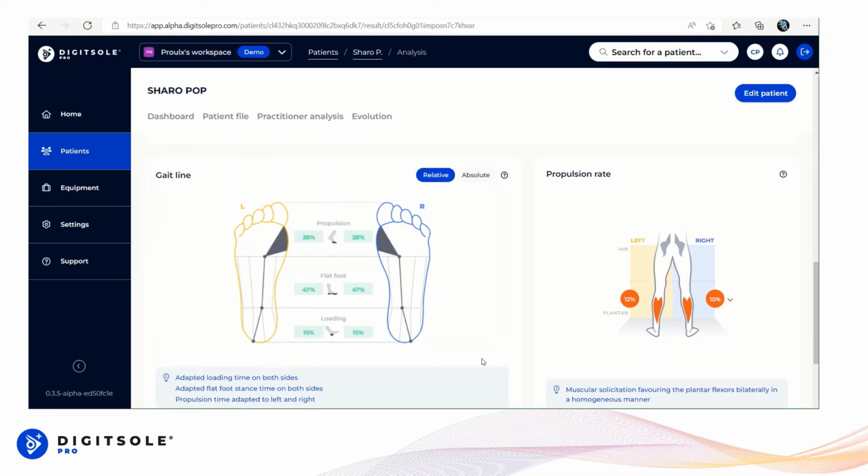So we can see at heel strike, we're landing just on the lateral aspect of the heel, which means that there's going to be a slightly inverted calcaneus. And as we go into foot flat position, we're going to transition, and typically what we see at the forefoot is going to be a pronation relative position.